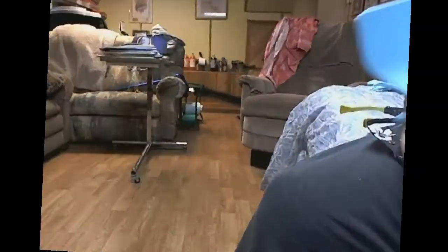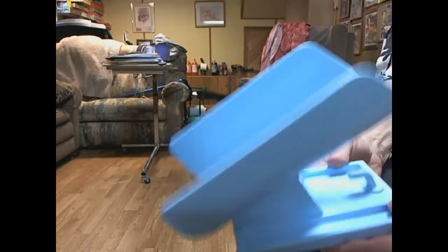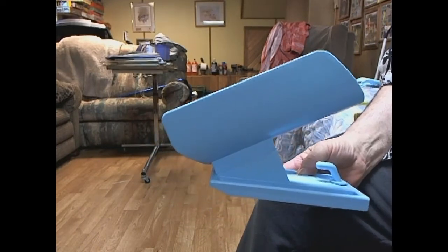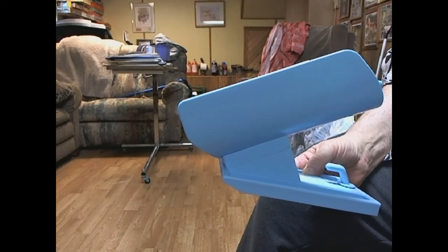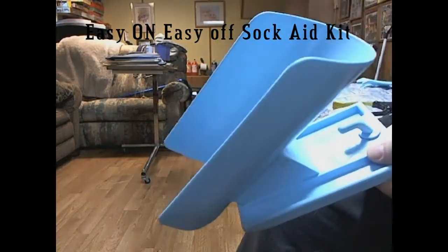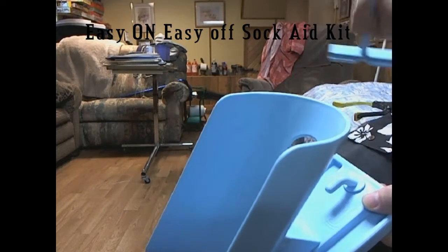That's my discussion. Now we're going to go to the demonstration portion of the show. We're going to stop the video and we're going to start with a demonstration of the sock putter-oner. Actually, it is called the Easy On, Easy Off Sock Aid Kit. It comes in 2 parts, this part and this part. And I'll show you what this is used for in a little bit.